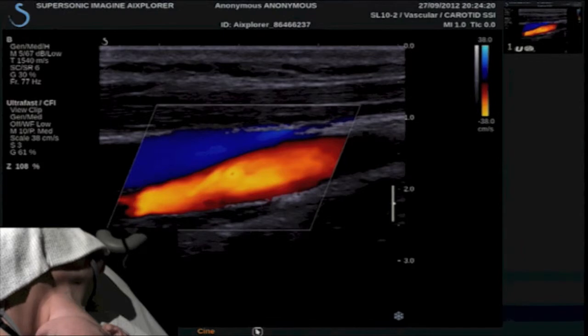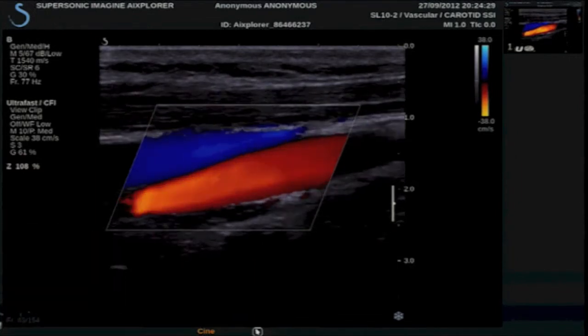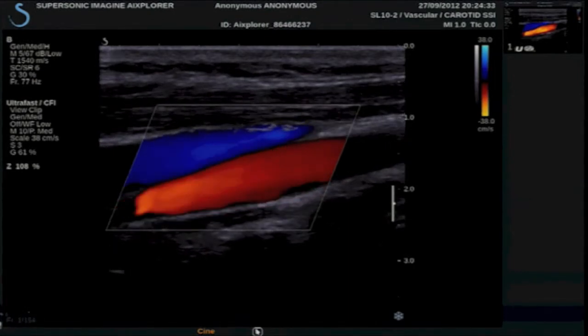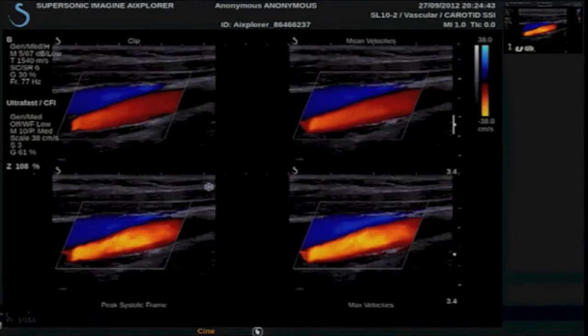Because this frame rate is so high, we have total synchronization with the cardiac cycle. I'm going to play the cine loop here, and you can see the excellent detail of the transient flow that occurs over the cardiac cycle. We can display this several ways — I am going to show you the quad screen format, which will allow us to look at four different views.